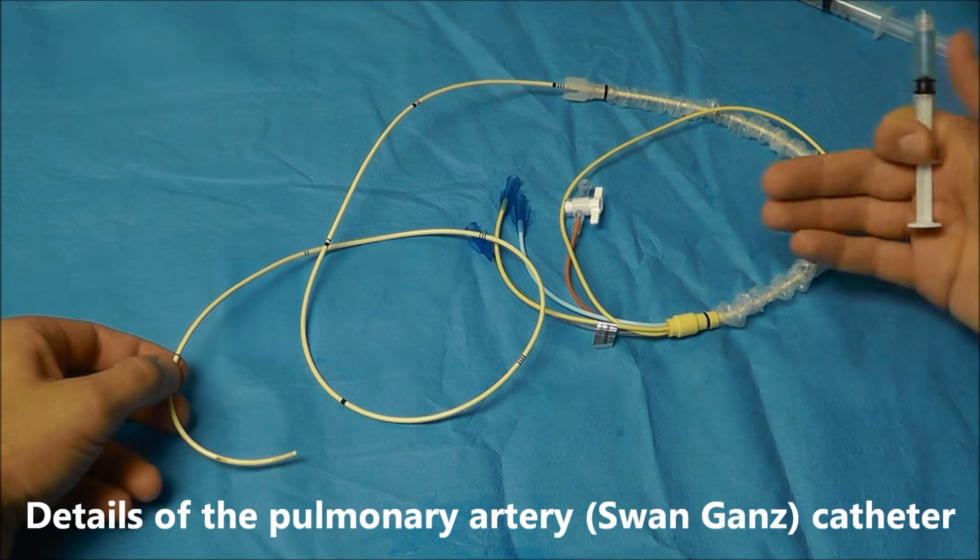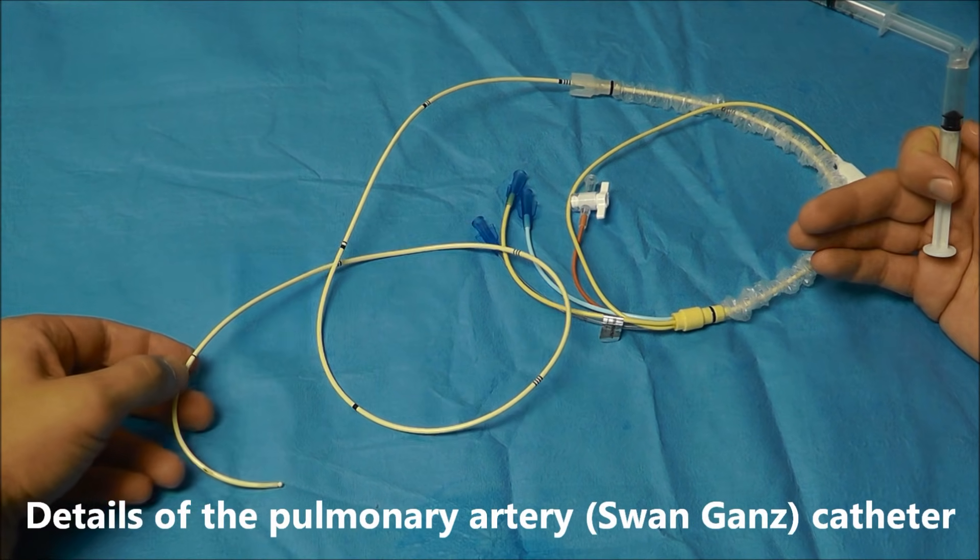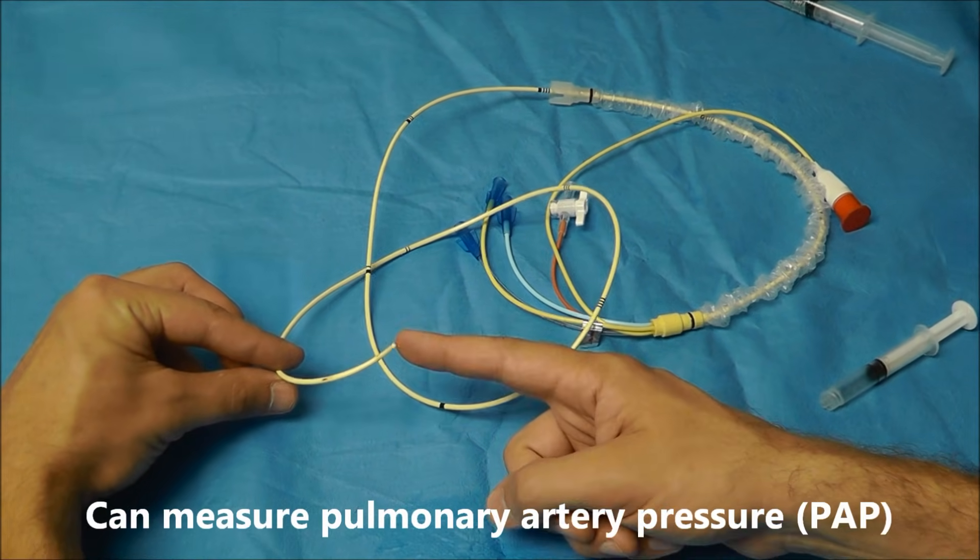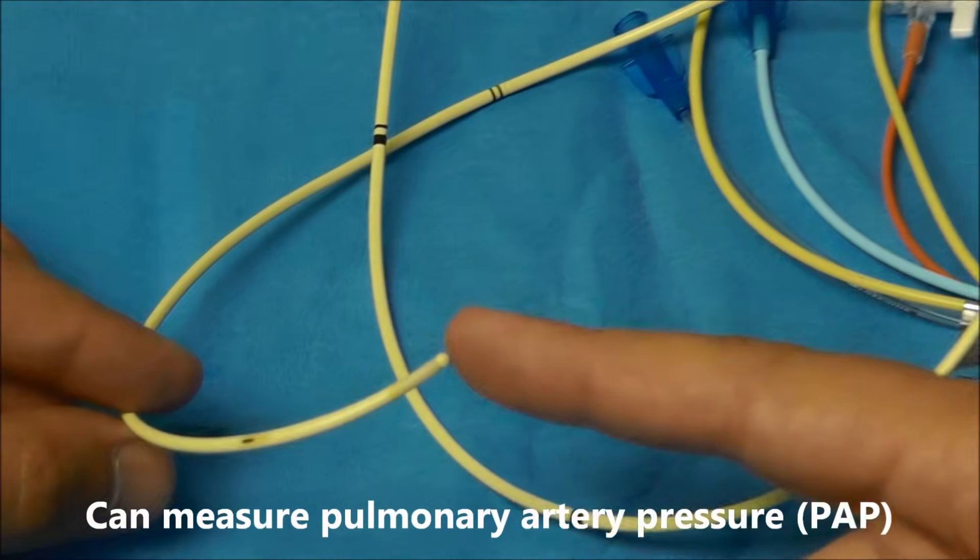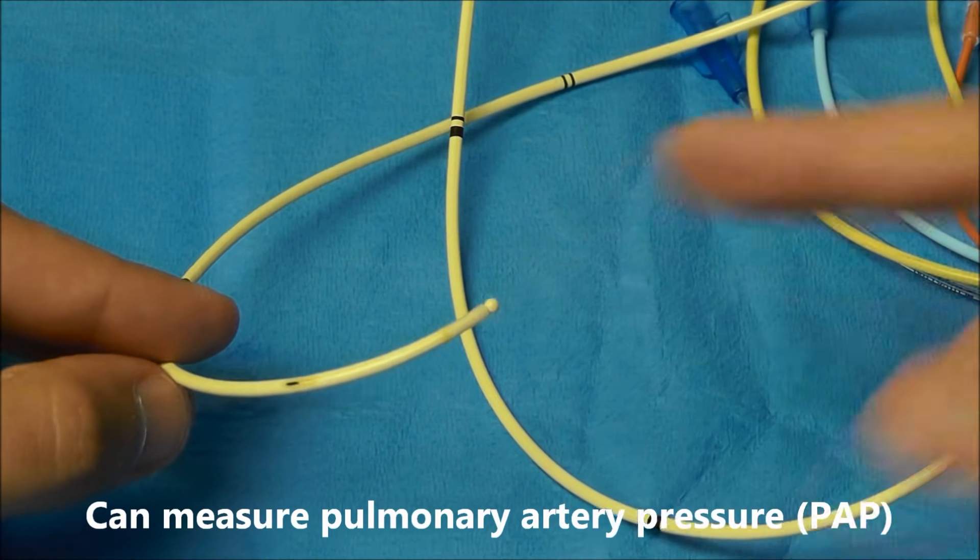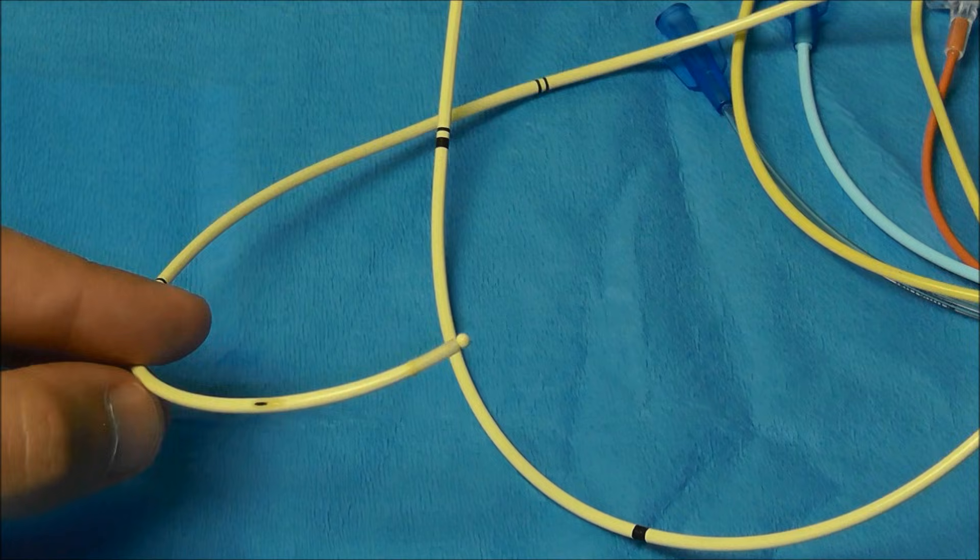Now I'd like to cover the pulmonary artery catheter here a little bit. Basically, the distal tip of this pulmonary artery catheter is designed to sit in the pulmonary artery so it can actually measure pulmonary artery pressure.